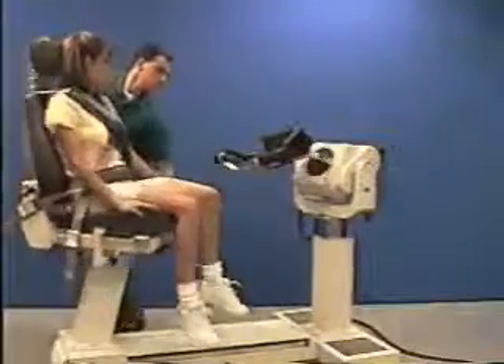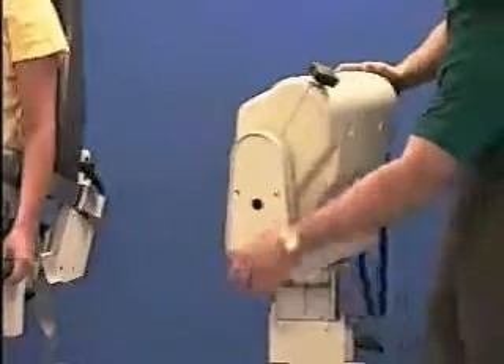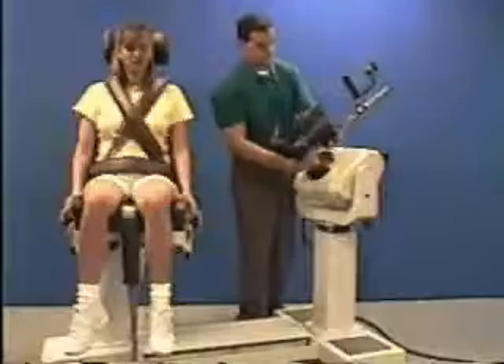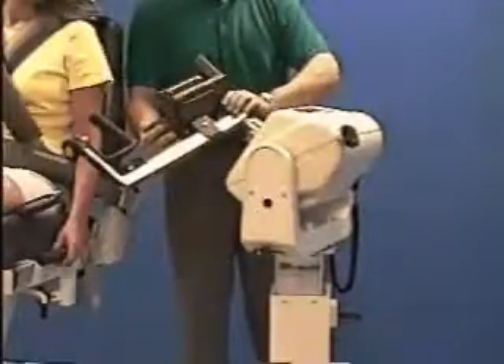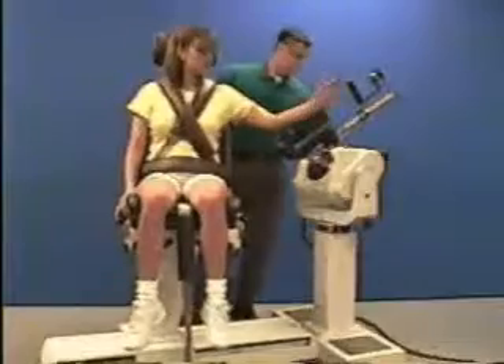Rotate the chair to 15 degrees and the dynamometer to 20 degrees, labeled shoulder modified neutral. Tilt the dynamometer to 50 degrees. Using the red dot, align the elbow shoulder attachment and secure it. Move patient into position and adjust the dynamometer to align the axis of rotation.